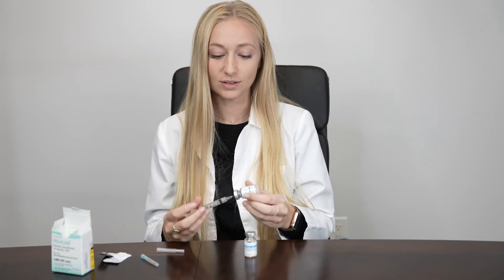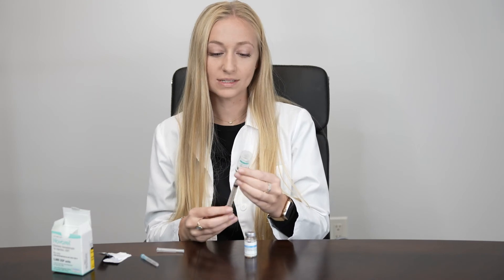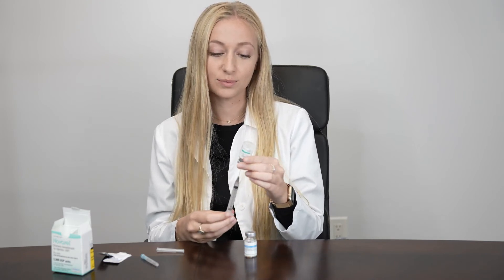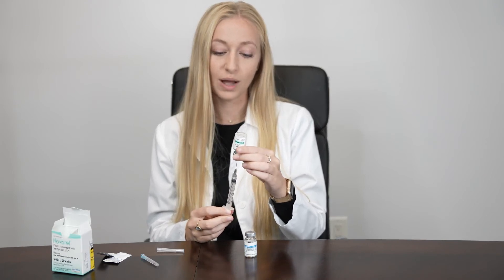If your dose is 2,500 units, you'll only take out half of the medication in this vial of 5,000 units. In this case, we put in 1 cc of liquid, so when you flip it upside down, ensuring that the tip of your needle is submerged within the liquid, you'll only pull out 0.5 cc, or half.